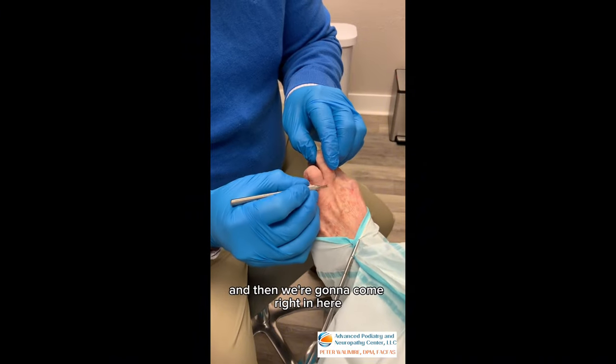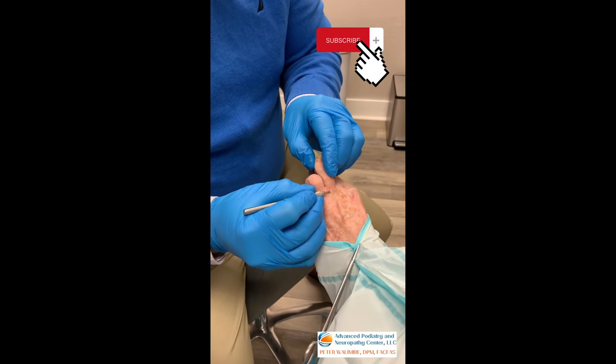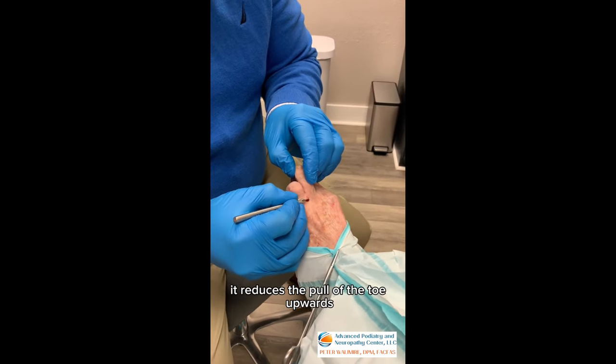We're going to come right in here and just release this tendon. What this does is it reduces the pull of the toe upwards.